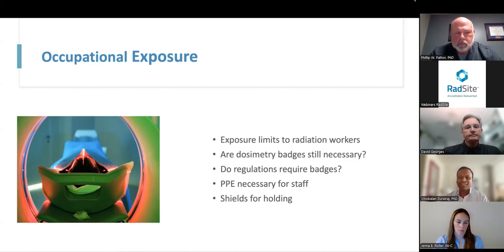Okay. Thanks, David. So in the weight-bearing ConeBeam CT world, Jenna, what do we see there? Yeah, I would say it's very similar to a lot of what David described, and Dr. Patton touched on this a little bit too. We have had to make our systems flexible enough that they can be installed in a number of different areas, and there are different state regulations that we still need to comply with.